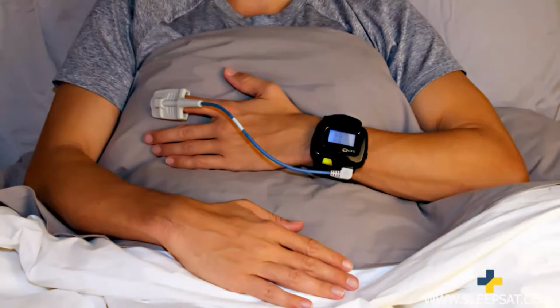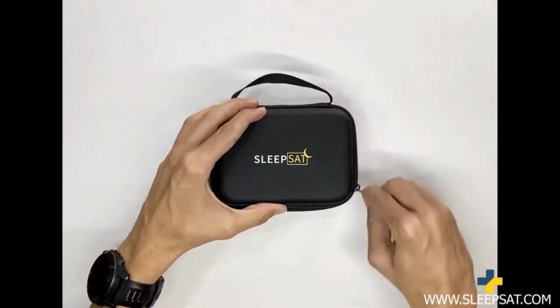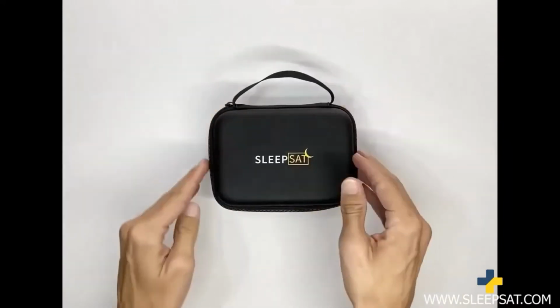Turn the oximeter on only when you're in bed and ready to fall asleep. If the finger sensor irritates your finger, switch to a different finger. Charge the device fully between nights. To begin, take out the patient instructions, finger sensor, and the SleepSat device. Remove your watch and any jewelry you are wearing as well.